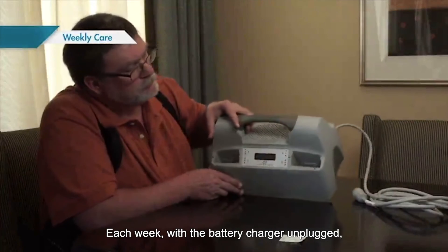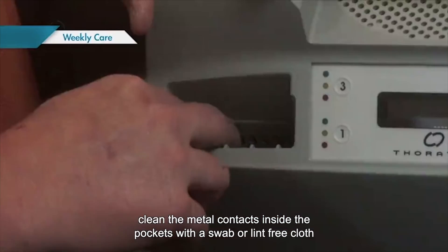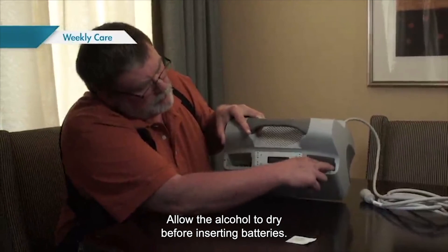Each week, with the battery charger unplugged, clean the metal contacts inside the pockets with a swab or lint-free cloth lightly moistened with rubbing alcohol. Allow the alcohol to dry before inserting batteries.